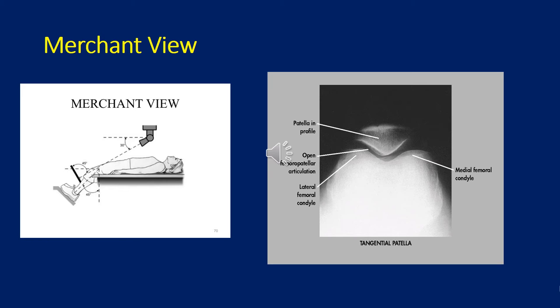You can see the patella in profile. This view is excellent to show if there is patella dislocation, patella subluxation, or patellofemoral arthritis.